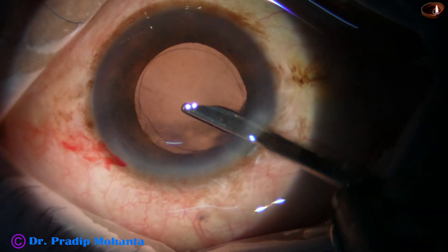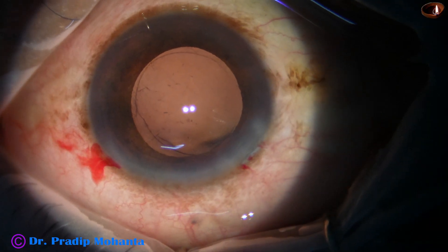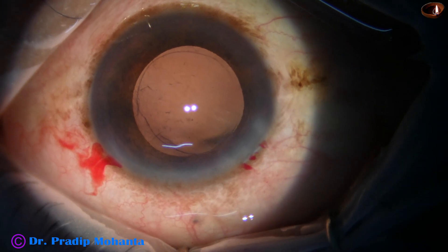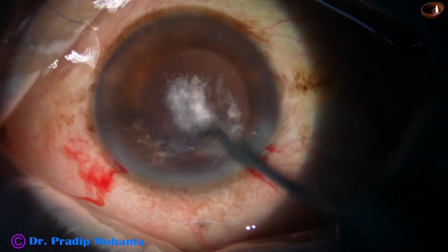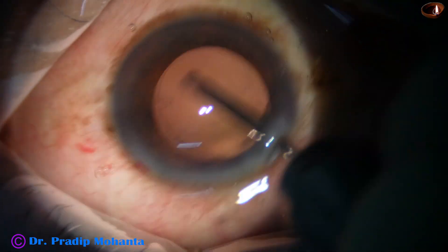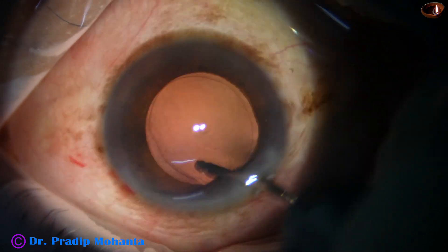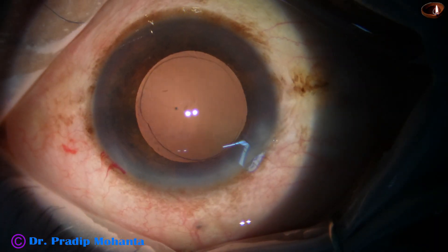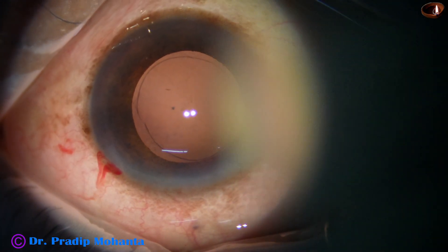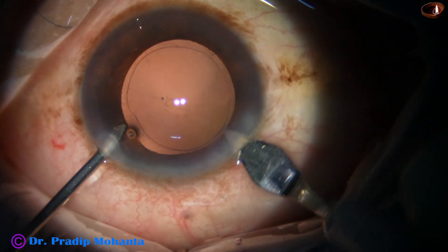The Simcoe cannula has been used and all the cortex has been removed. The posterior capsule is polished by the irrigating probe only — the irrigating fluid is swept over the posterior capsule and all the cells that stick to the posterior capsule are dislodged.